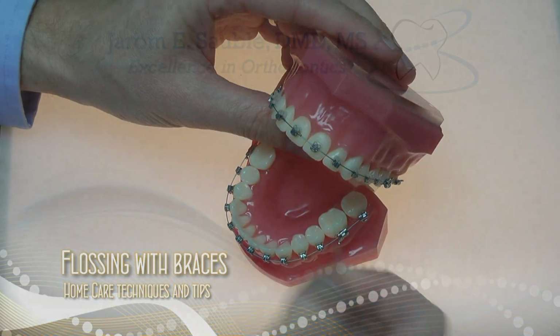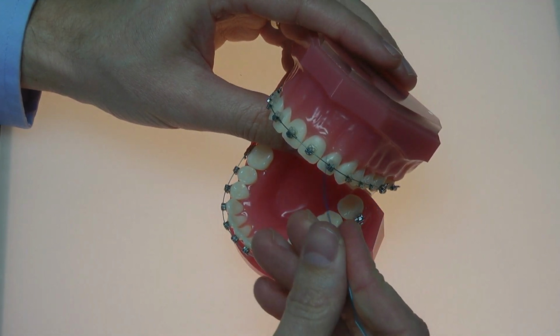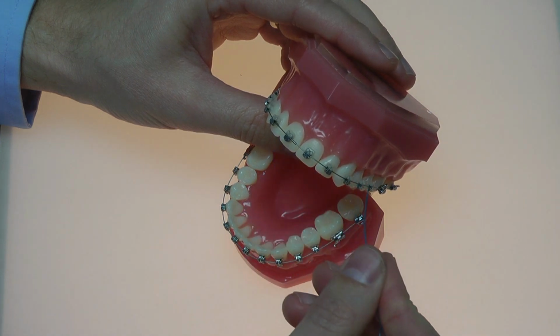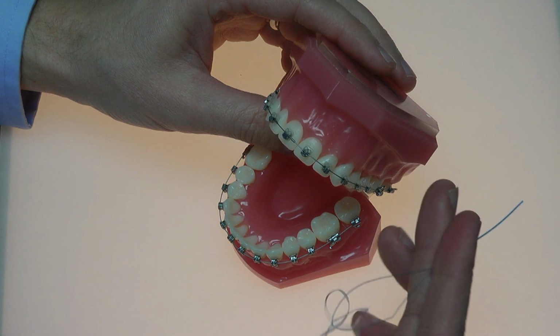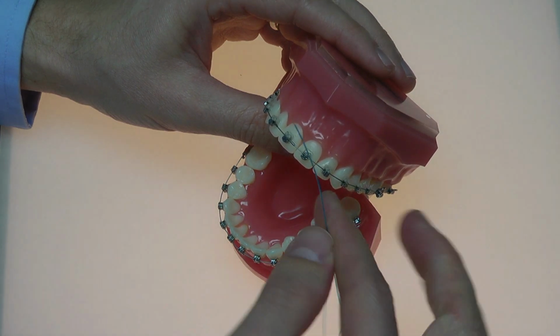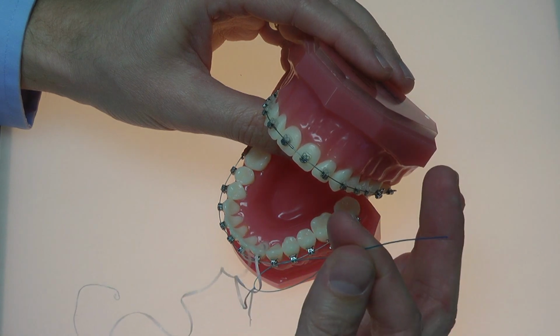This time I'm going to demonstrate proper flossing technique. Flossing is a very important part of having braces, keeping your teeth clean with braces on. And there's a couple ways to do that that'll make your life a little easier. One of the ways is with a floss threader.